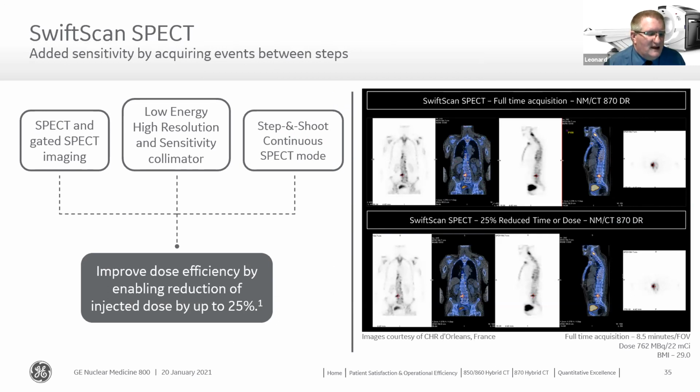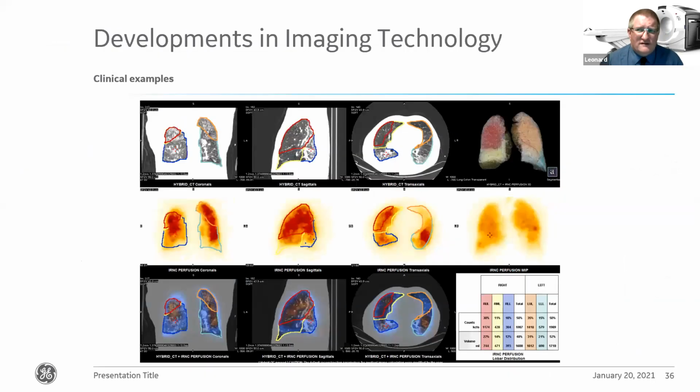The main driver that we want to take this forwards for, when we're looking at current things, is that we're talking a lot more about theranostics. Theranostics is where we're looking at a patient, trying to do a review of what exactly is happening with their disease, then providing them with a treatment and then reviewing that treatment response. All of that is undertaken within the nuclear medicine department to make sure we can monitor how these patients respond. And ultimately, we can either adapt their treatment or target it more specifically. Quantitation also extends into the context here, where rather than just doing imaging to get a characterization from a pattern, we're also getting numbers and statistics out to be able to better map and manage the patient treatments through these phases.